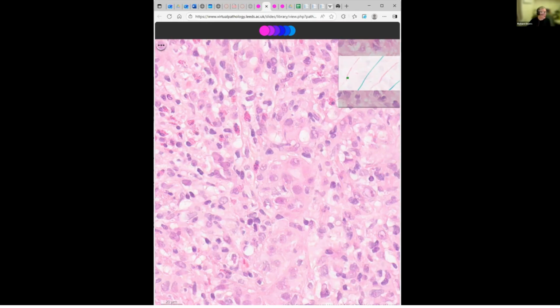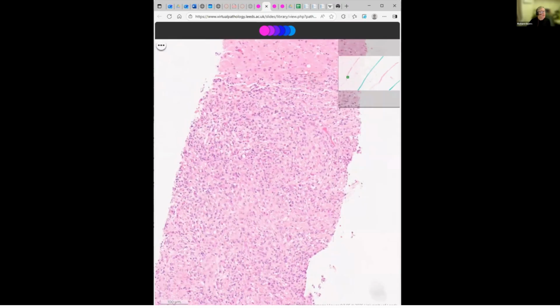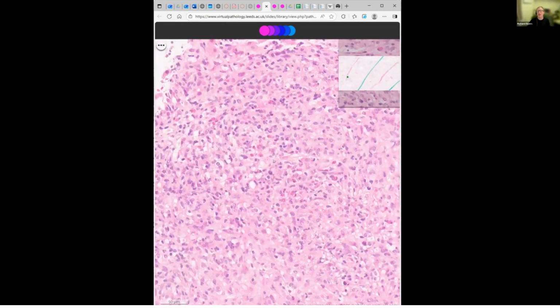I'm just wondering, LCH as a diagnosis, what were you thinking there, Nengu? Langerhans cell, very good. Okay, yep, that's a good one too.